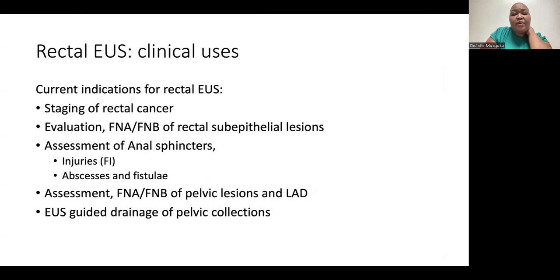Right. So now that we know a little bit more about anatomy, we have to practice it a little bit more, even I practice it quite a lot. Vikash and I are always looking at gray areas in the rectal EUS and trying to figure out where we are. But again, if you follow the 5 echo layers and follow the muscularis area reliably, that's what's going to get you all those anatomical structures.